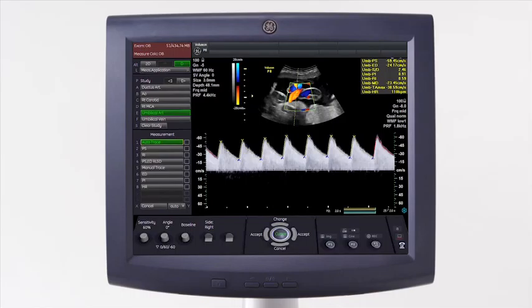Trace can be performed manually with trackball and set, or performed with the auto trace function. After activation from the display menu, adjust the endpoints using the trackball and set keys to change the endpoints and set the measurement.